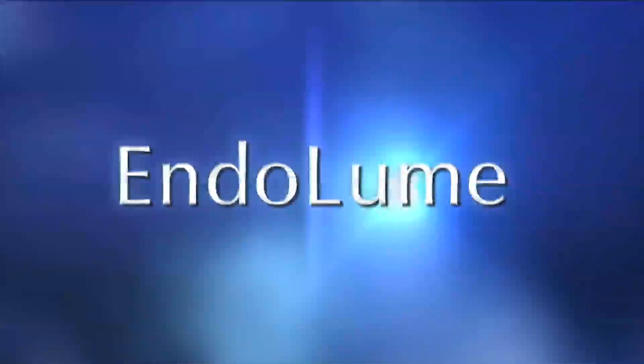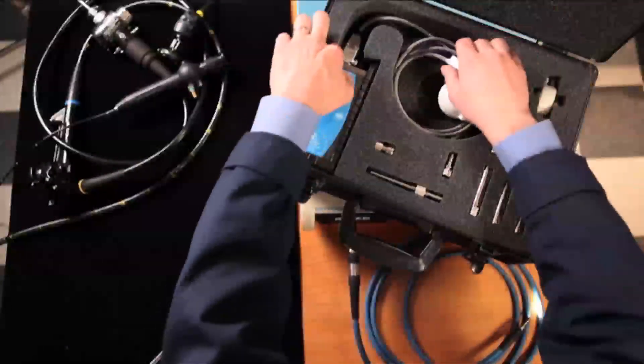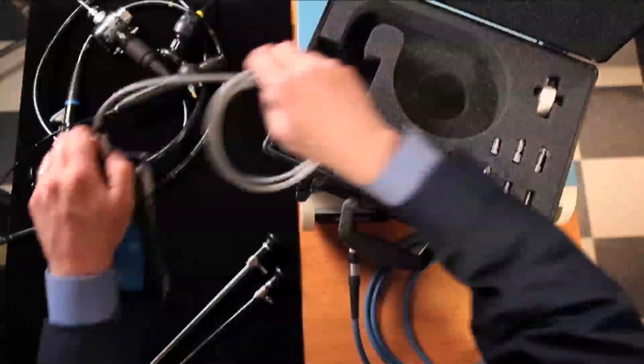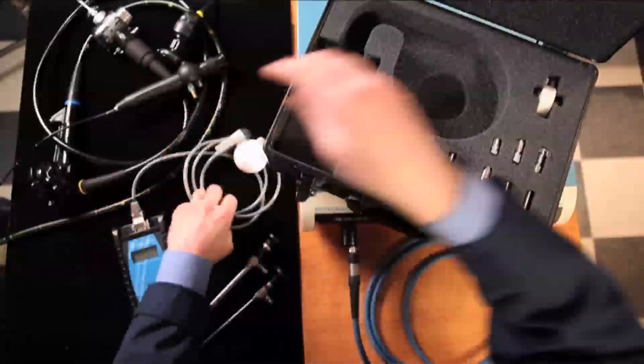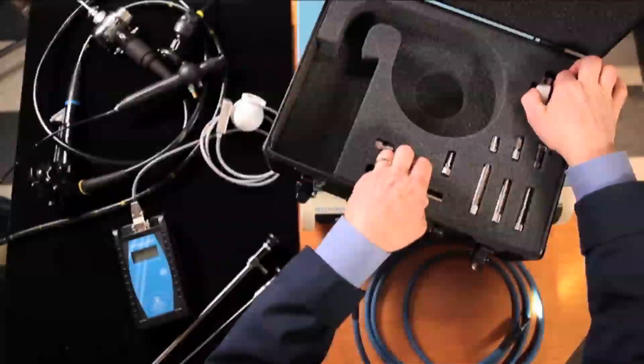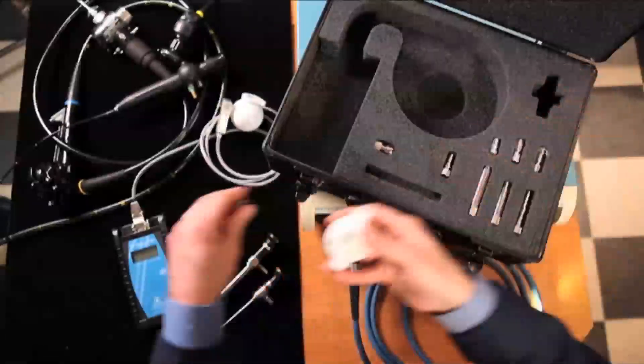The Endolume Endoscope System Photometer isolates endoscopic illumination failure points and quickly assists in a cost-effective approach to repair, all in a simple-to-operate portable kit.